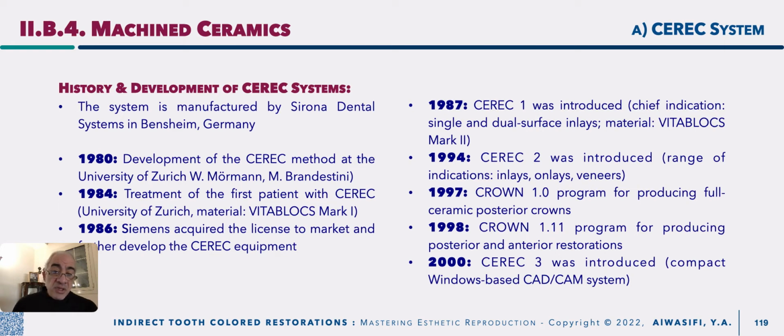In 87, CEREC 1 was introduced. In 94, CEREC 2 was introduced, increasing the range of indications to inlays, onlays, and veneers.